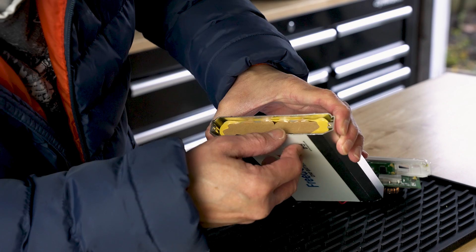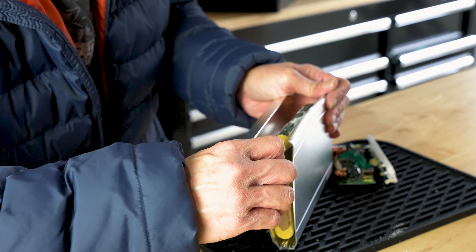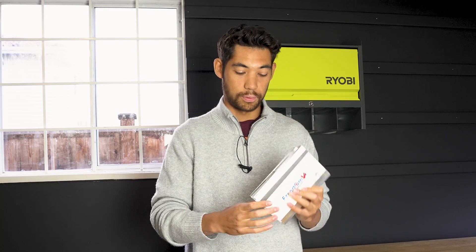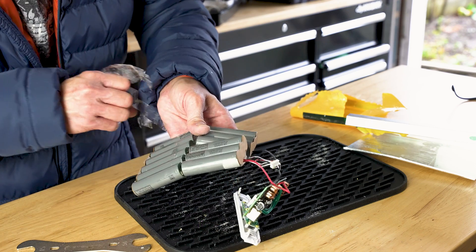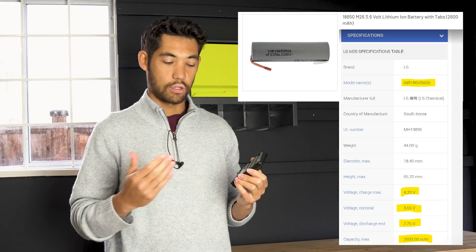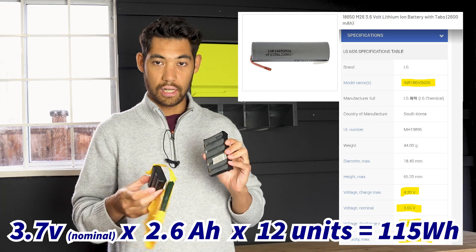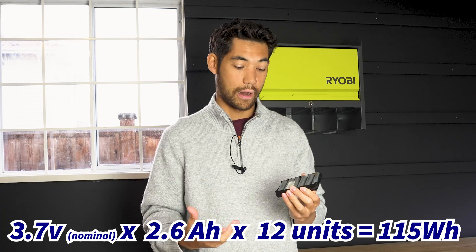I had an electrical engineer friend of mine come over to help me open the battery safely, and we did that. As you can see, we sawed it open here and out came 12 cells. Each cell, after looking at the product number and finding them on the internet, they are about 3.7 volts at 2600 milliamps. So if you multiply that together times 12 different cells, you get 115 watt hours.